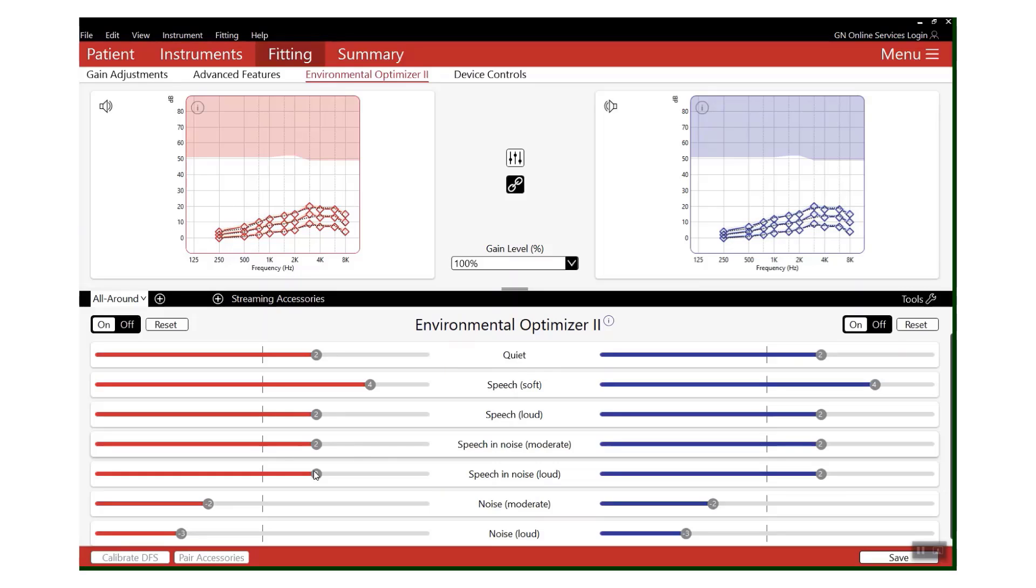Now, so far all we've done is increase the overall gain of the hearing aids when they are classifying into that speech in noise environment. Let's be honest, that's not really going to solve the problem - we've just made it a bit louder.